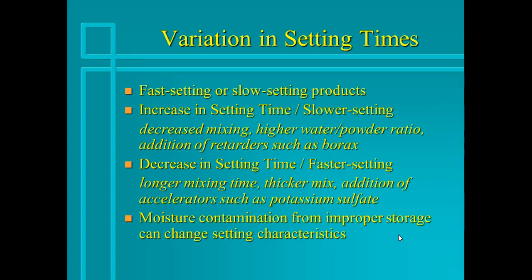So now let's discuss variation in setting times. The setting time of a gypsum product is controlled by the manufacturer's particular formulation. Several gypsum products are available with varying setting characteristics. Either a fast setting or a slow setting product can be purchased. Sometimes it may be necessary to modify the setting time of a gypsum product in the dental office. Increased and decreased setting times may be obtained in the following ways.